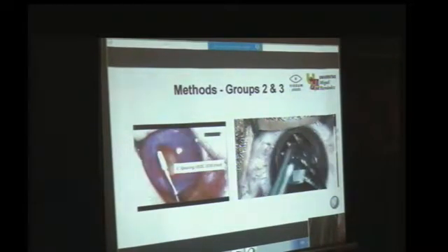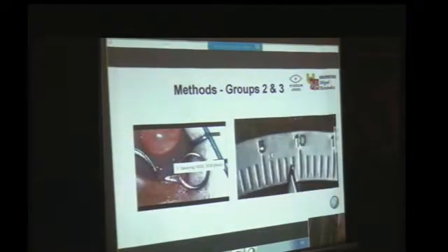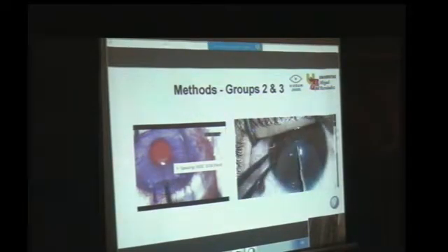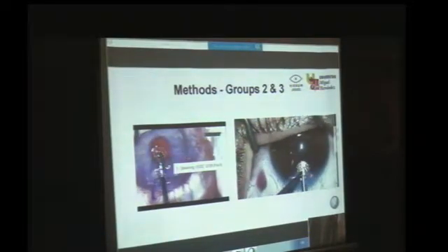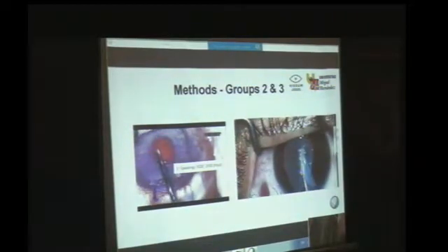Look, the lamina looks moderately opaque because of the edema that is caused by the decellularization process. The lamina is, as you see, 9 millimeters in a 9.5 pocket, and we are using the same technique that we use in the experimental animal. That means sliding this lamina into the pocket, expanding it. You see that it's not this difficult. The wrinkles are not appearing.